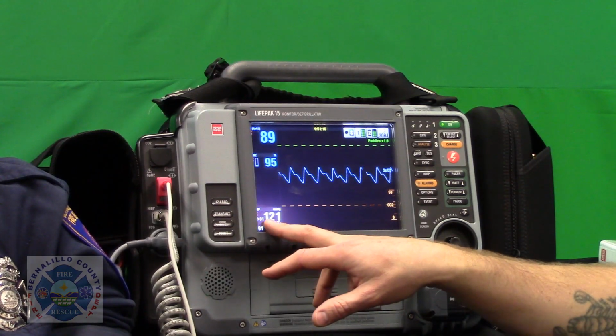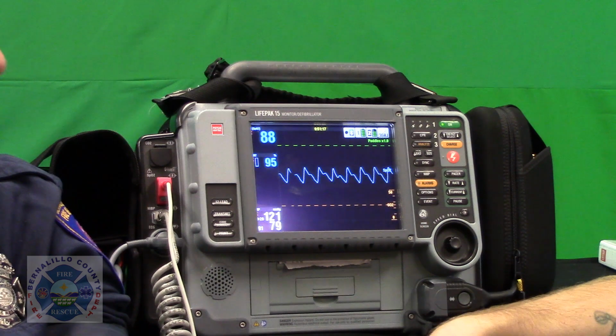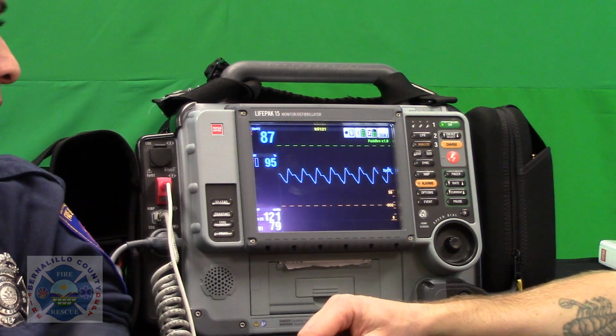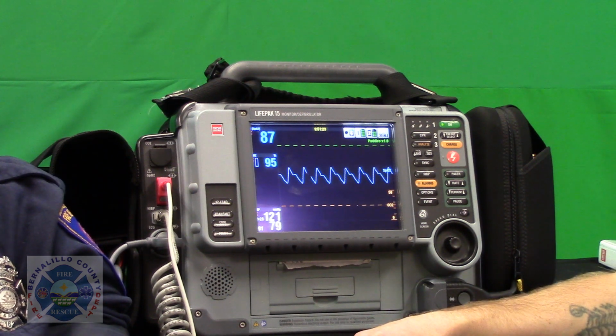So we set it for every 2 minutes, and you see the countdown timer is added to the screen. And here in about 27 seconds, we're going to be asking the monitor to go ahead and give us an updated blood pressure.